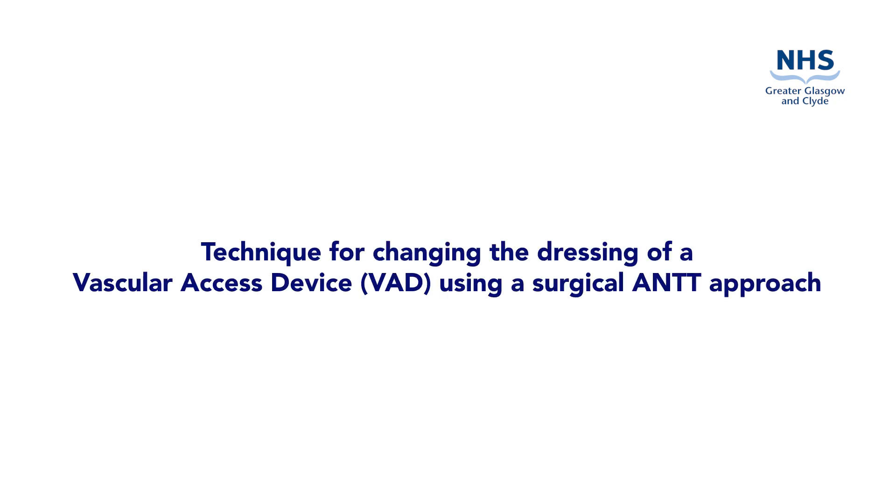This video is to demonstrate the preparation and procedure to change the dressing of a vascular access device using a surgical aseptic non-touch technique. A surgical ANTT approach may be used when changing the dressing of a vascular access device and is commonly used when changing the dressing of a PICC.